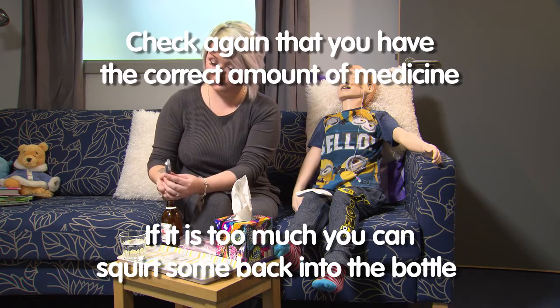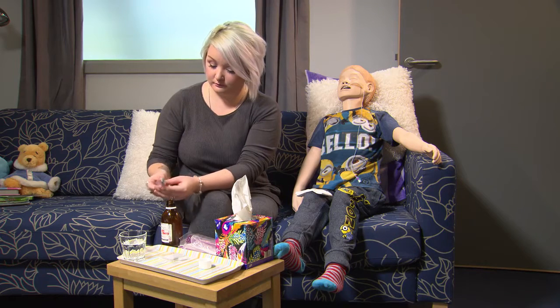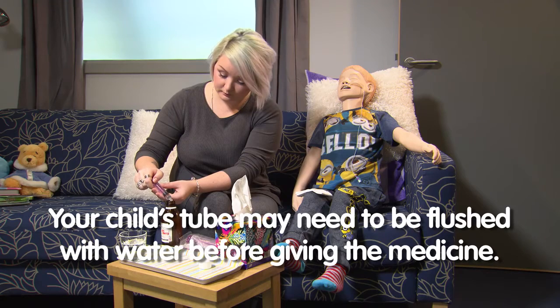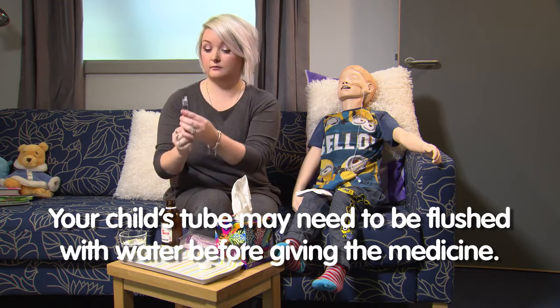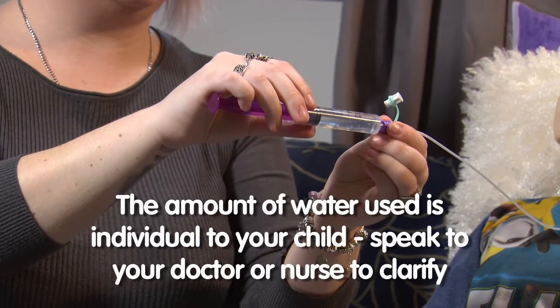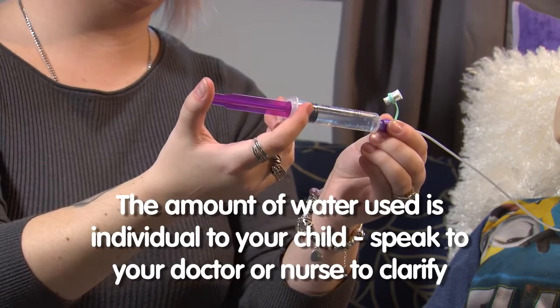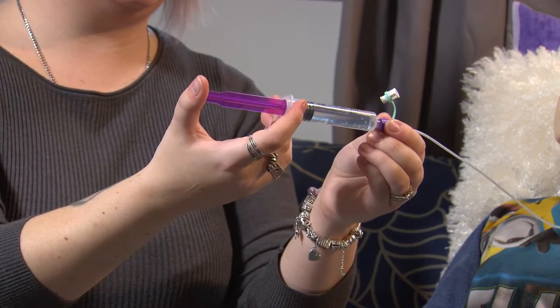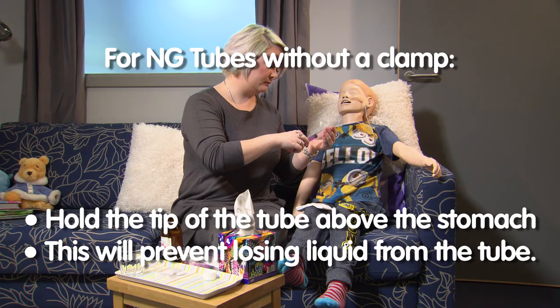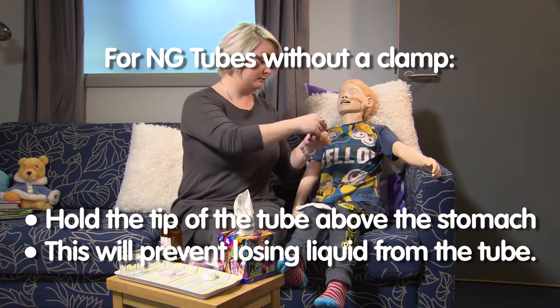Once you are sure you have the correct amount of medicine, you can start the flush. If your child's tube is being used for a feed, then you must stop the feed and flush the tube with water before giving the medicine. The amount of water used to flush between feeds and medicines is individual to your child — speak to your doctor and specialist nurses to clarify this. If you have an NG tube without a clamp, you need to hold the tip of the tube above the stomach to prevent losing liquid from the tube.